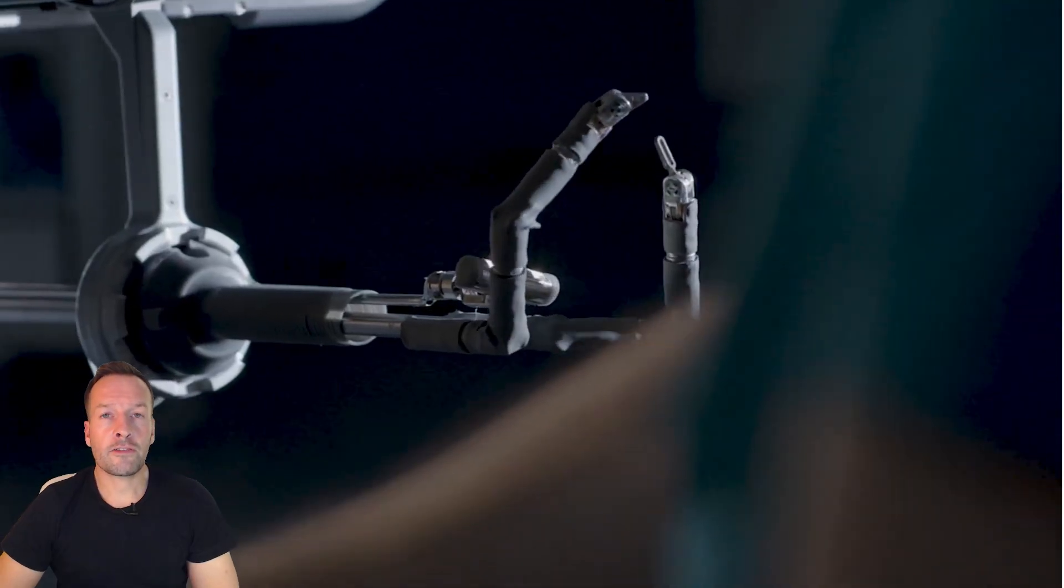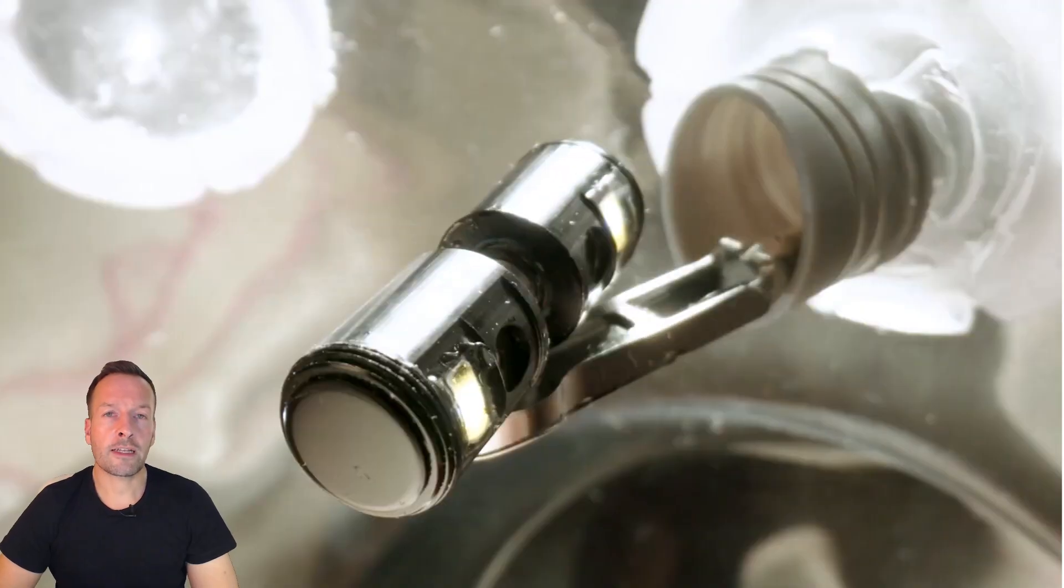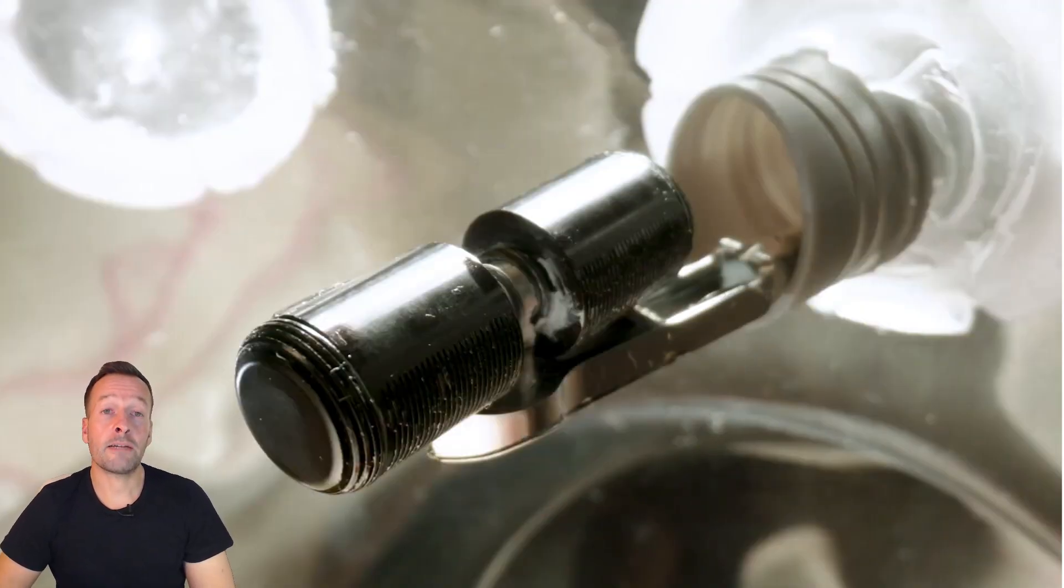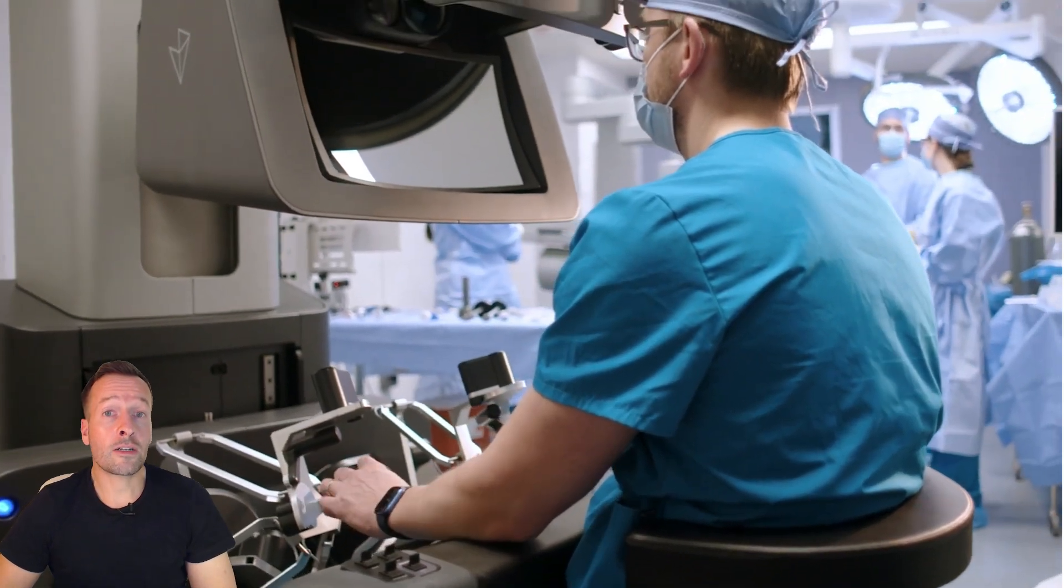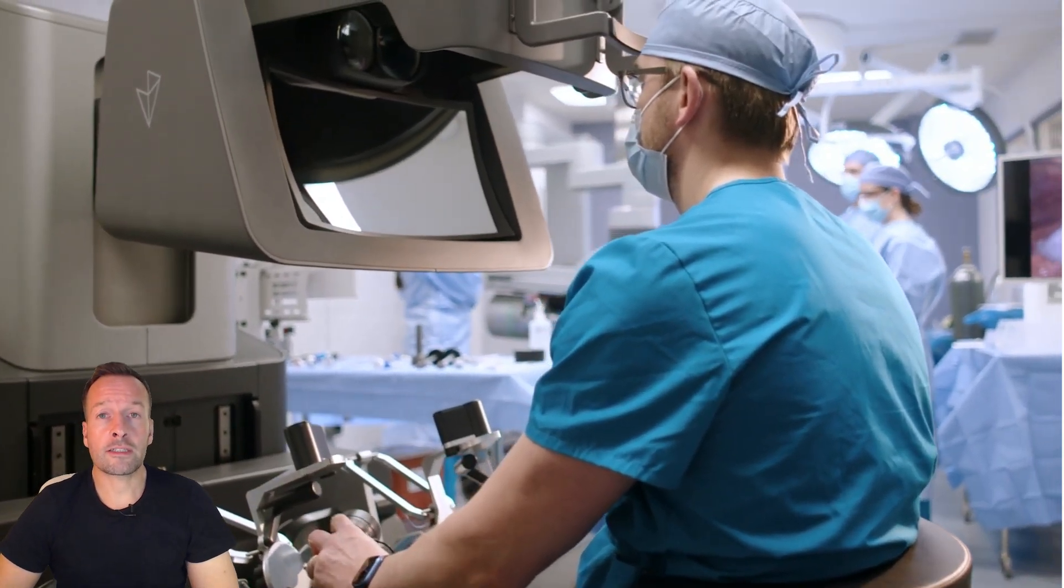Hi guys, Robo Phil from Robot Philosophy with another news update for you. Today we're looking at Vicarious Surgical, where tiny robots are revolutionizing surgery.